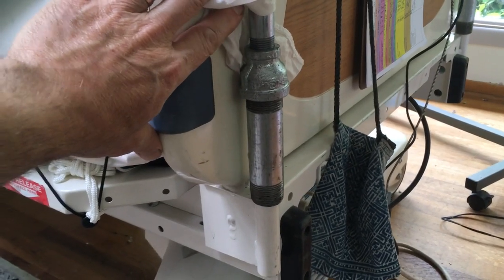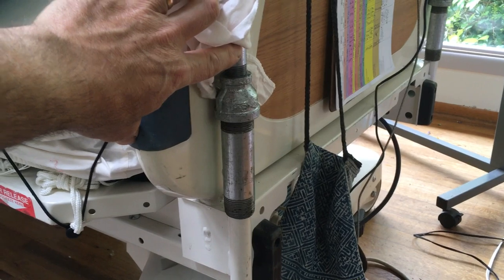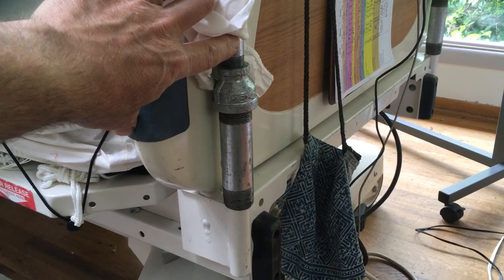If you had a heavier patient and wanted a more robust system, you might go to a three-quarter inch pipe, but the half-inch has been very serviceable for us.